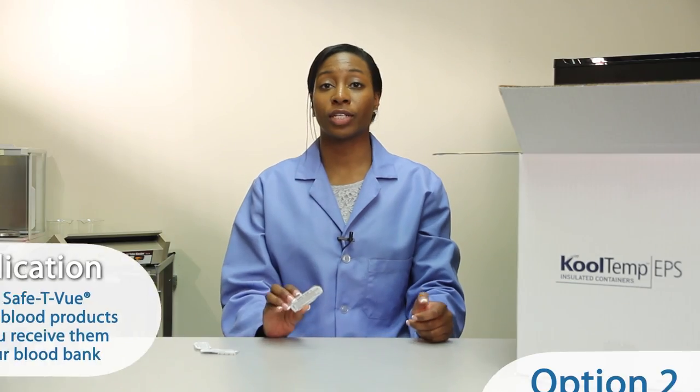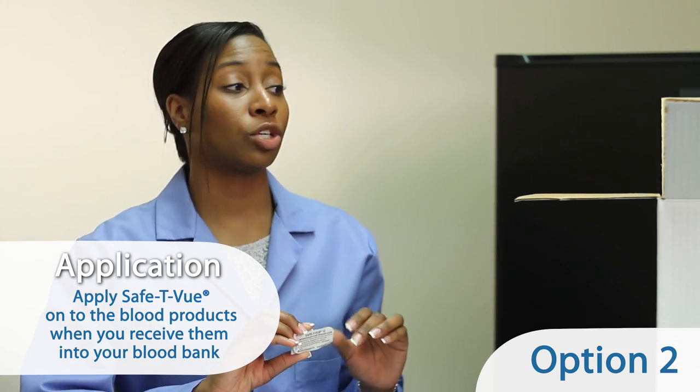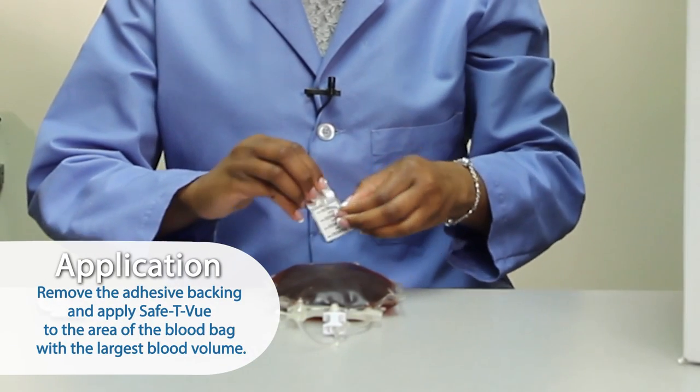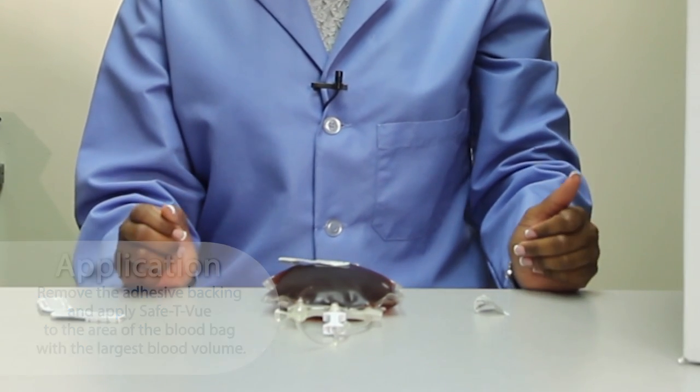Another option is to immediately apply a safety view indicator onto blood products when you receive them into your blood bank. Remove the adhesive backing and apply safety view to the area of the blood bag with the largest blood volume.